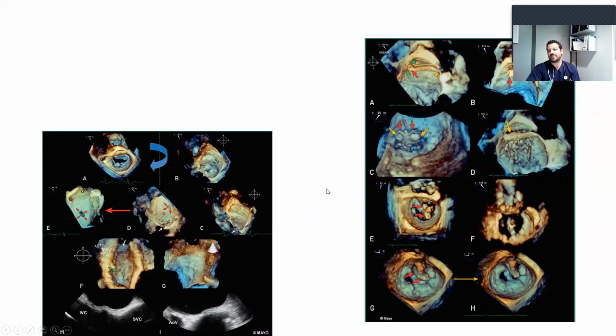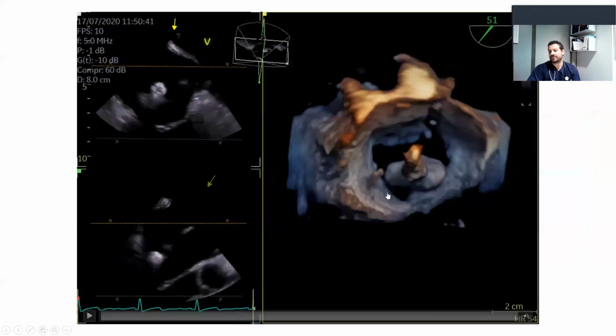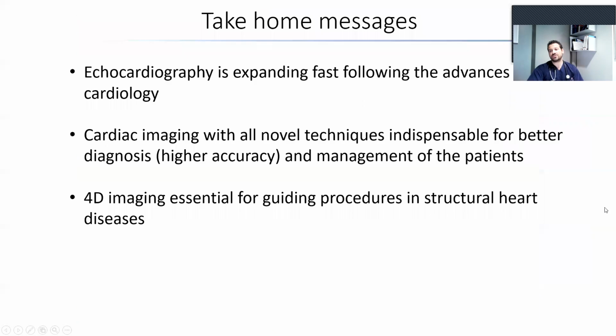And of course, in mitral clip implantation, we have several steps where we use 3D echocardiography, but mainly when we want to see the perpendicularity of the clip with the arms open to the coaptation line. So in all transcatheter interventions, it's very important to acquire 3D images in order to finalize our implantation of the device.